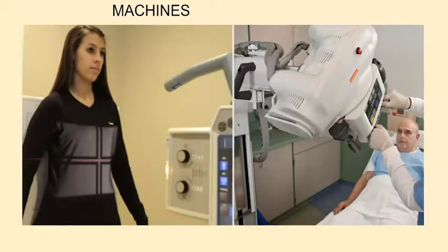There are different ways to acquire diagnostic radiology images. The first one is with the patient coming to the radiology department. The patient is standing upright. This is the radiation source, and this is the detector that absorbs the radiation and creates images. The second way is to acquire the images using a portable machine. As you see here, the machine is taken directly to the patient and images are acquired.